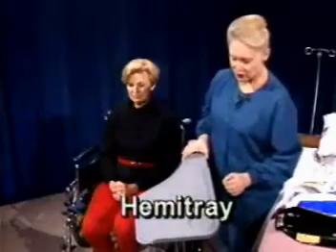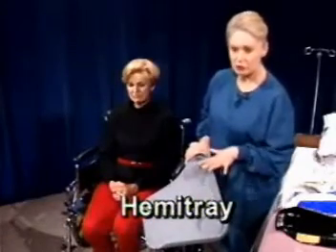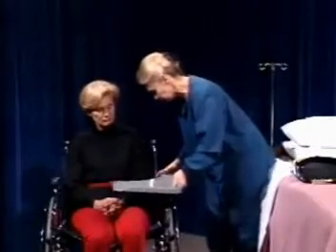A hemi-tray is made out of a hard plastic material that's easily cleaned and should be kept clean for the patient, PRN, or what that means, as needed, not just reviewed in the morning or when it's taken off of the wheelchair at night, but to be reviewed periodically through the day. Warm soap and water will clean it. There's a bracket underneath that fits into the wheelchair armrest that we're going to slide on right now.